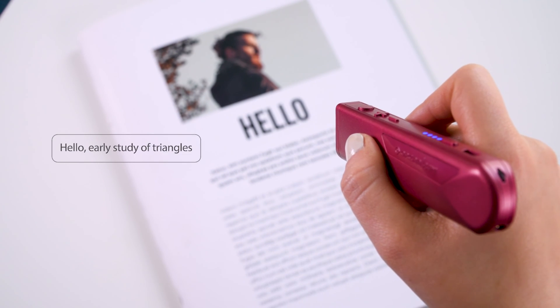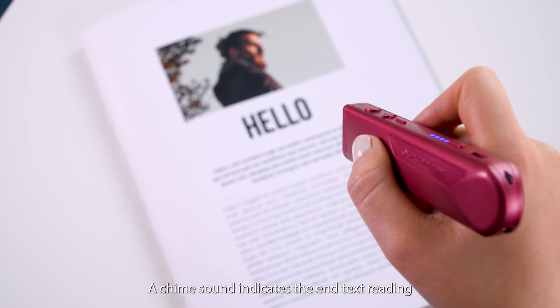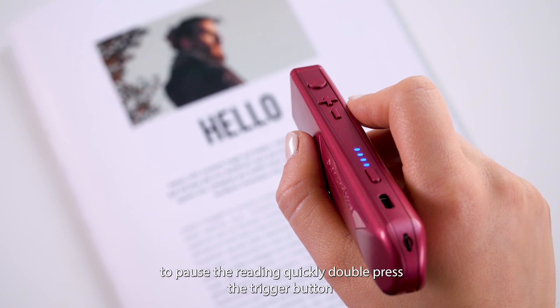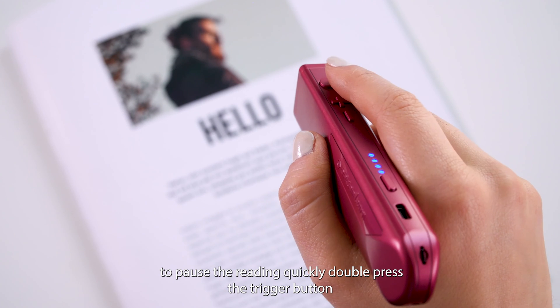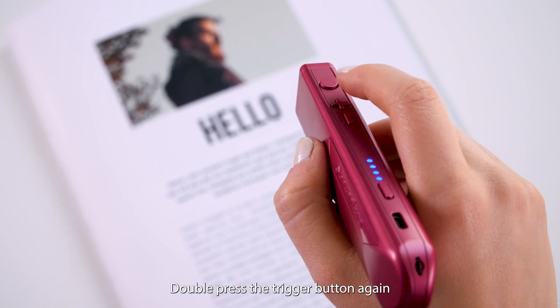Hello, early study of triangles. A chime sound indicates the end of the text reading. To pause the reading, quickly double press the trigger button. To resume reading, double press the trigger button again.